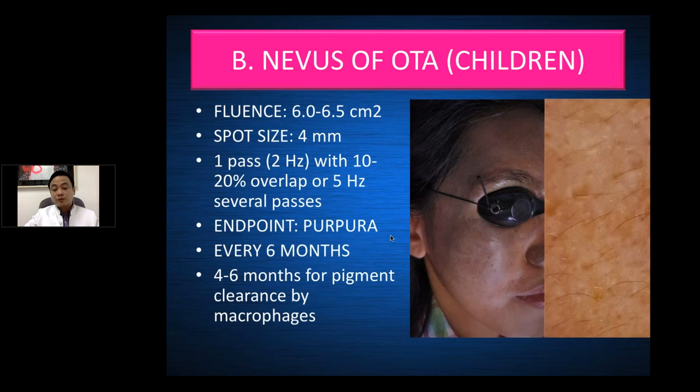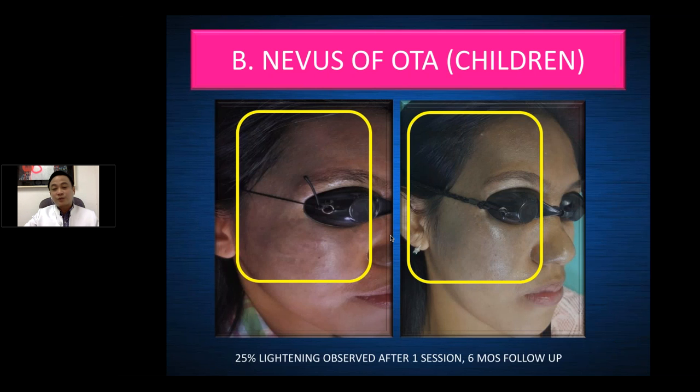So this is just one of my patients in which 25% lightening was observed with only one session, but I told the patient that she has to wait for 6 months before her next follow-up. So this is now the practice of most laser experts.